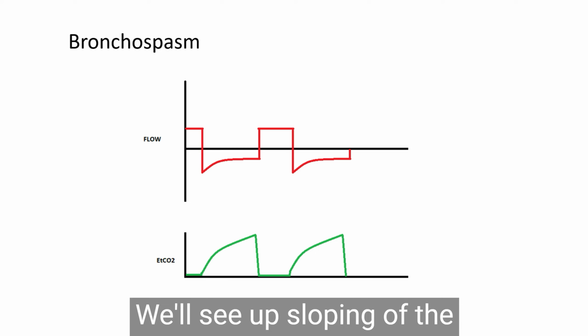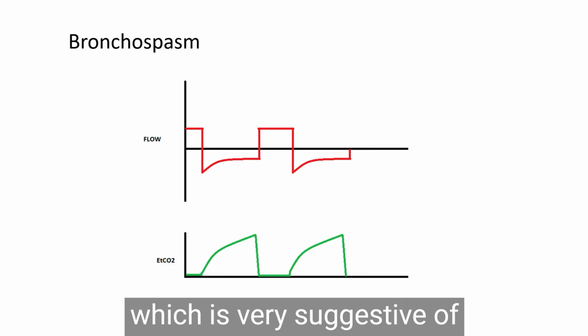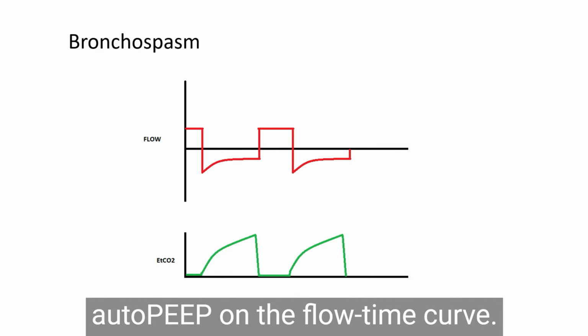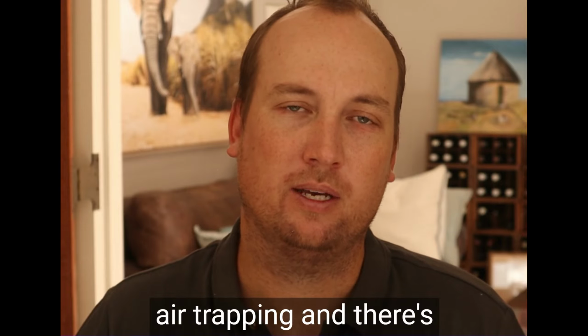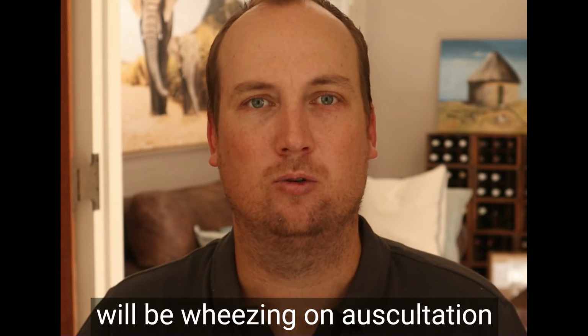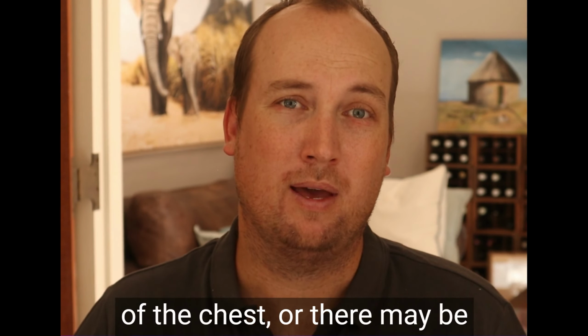We'll see upsloping of the capnograph waveform, which is very suggestive of bronchospasm. And we'll see auto-PEEP on the flow time curve. That means that there's air trapping and there's inadequate exhalation.